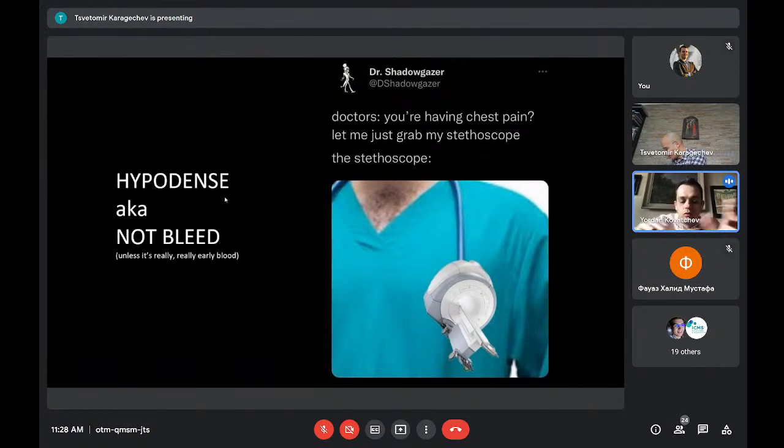So I'll show you the most important parts of the brain that are related to what we're talking about. We can't learn the whole brain anatomy in one day or even a week, but I just want you to remember when you think about anatomy that even if you don't know something while you're reviewing a CT scan or you're talking about a colleague, just try to make a logical connection and to figure it out, to research.